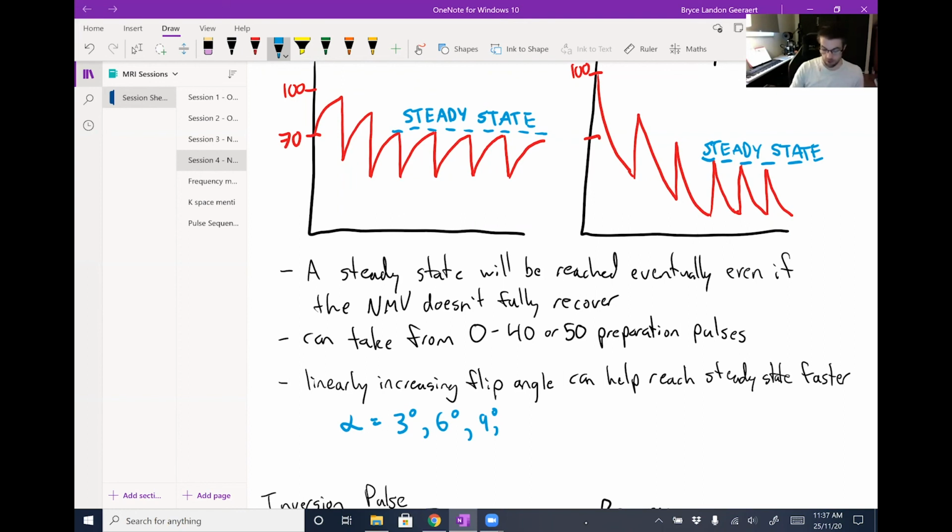Okay, so then after this, we'll go to 13 and then 16 and 20 and so on, and bigger jumps until we reach about 60 degrees. So it ends up being quite a significant flip angle. But this kind of process, depending on your tissue and your scanner and your gradients, all this kind of stuff, you can modify your flip angle to prepare tissue of interest quite quickly.